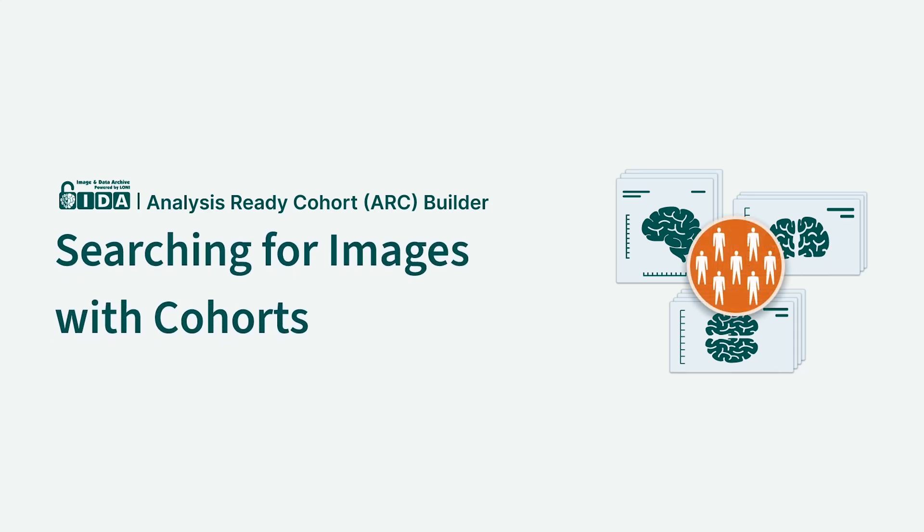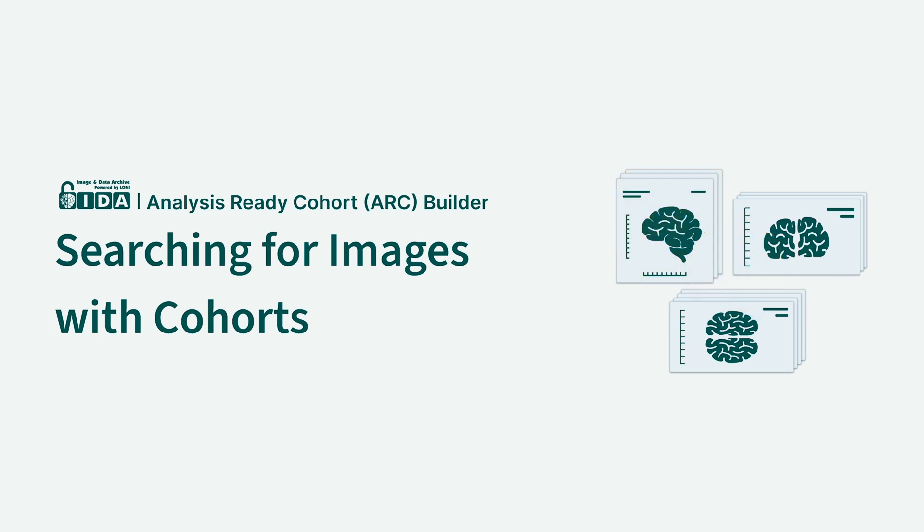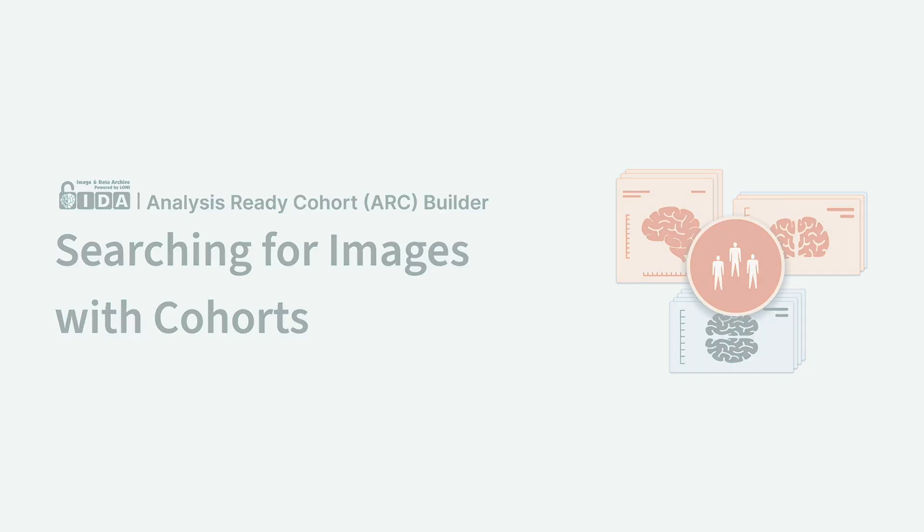This video demonstrates how to use cohorts to find and download image scans. Watch the video named Introduction to Cohorts to learn how cohorts are used in the IDA for searching and downloading data.